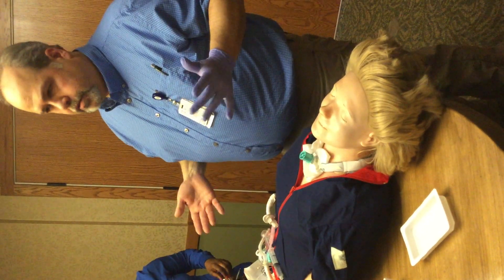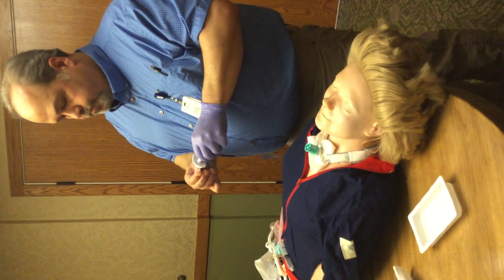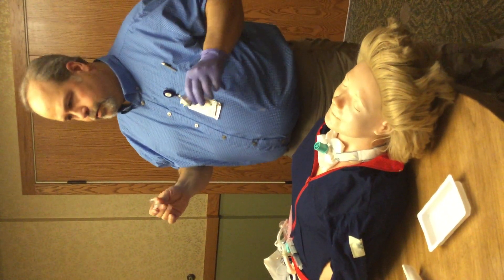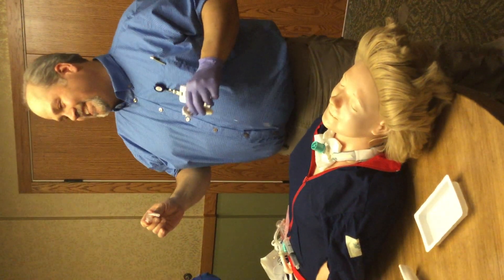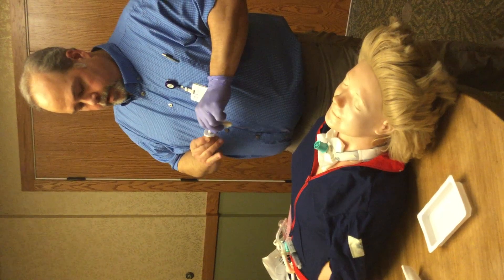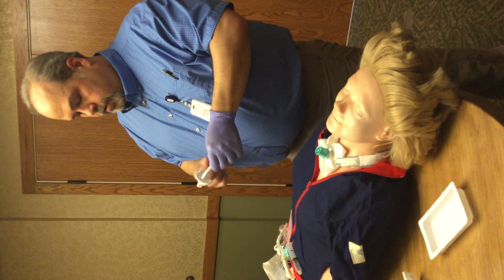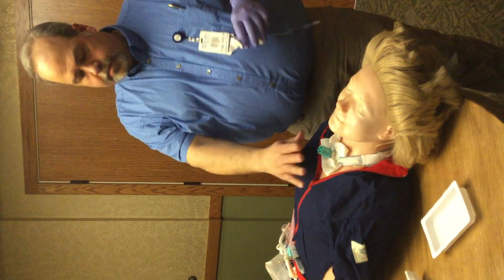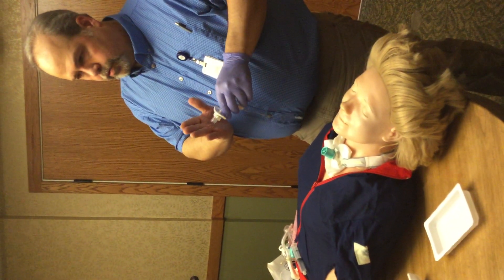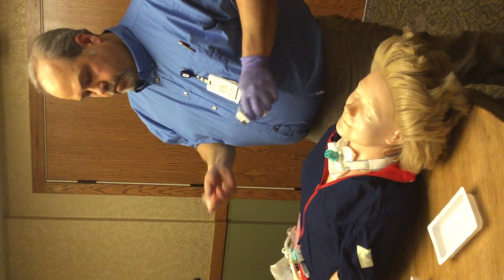The inner cannula itself is usually changed once a shift — about every 12 hours. Just pinch it tight, it's like a clothespin — it just pops out and you catch it. The nice thing about having the cuff down is the patient shouldn't be coughing too much into here. As long as the speaking valve is on, some stuff will get in there but not a lot because it's closed off — it should be coming around the tube, maybe getting some on the tip. Then you pitch it and put a new one in.